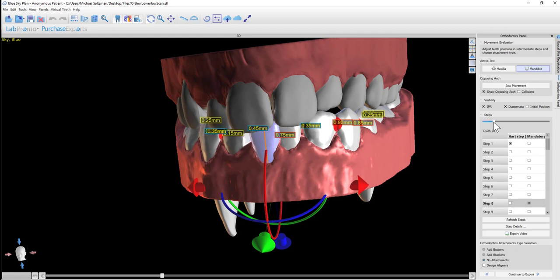How are the steps created? The software looks at the maximum tooth movement limits that we showed previously. It also takes into consideration if we chose monthly, bi-weekly, or weekly. And then based on that, it calculates the number of steps that it needs to get the teeth from the initial positioning to the final positioning.